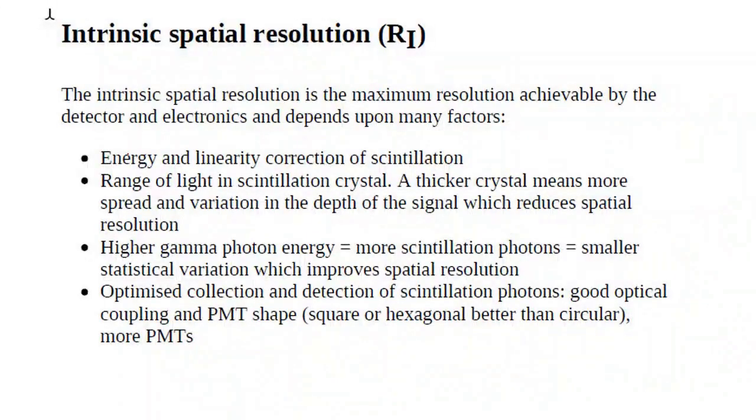That's why the tests conducted on any machine are called quality control, which is performed by the medical physicist, and part of it is done by the technician who tests the efficiency of the machine to see if it reads correctly and measures efficiently or not. Now, who performs the calibration? It's the engineer. The engineer comes in if you have a result from quality control that is incorrect. At that time, he makes a readjustment to the detector saying, no, adjust it.